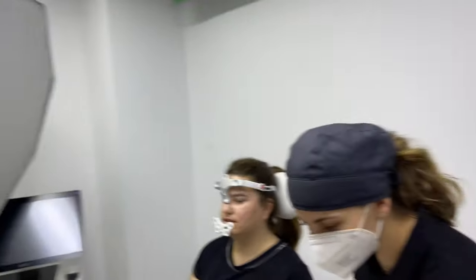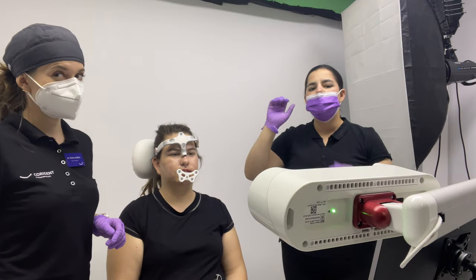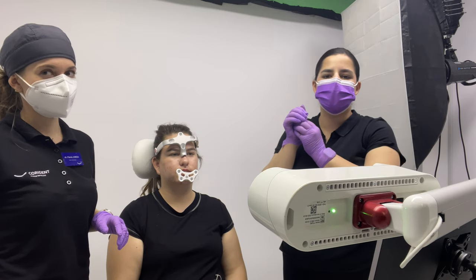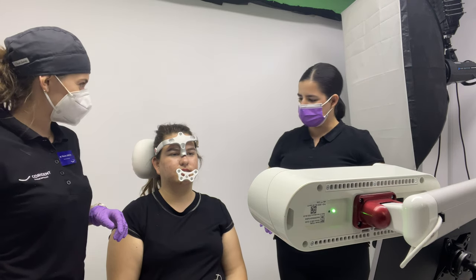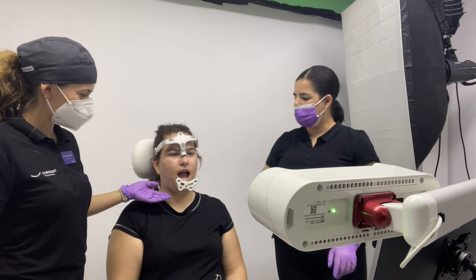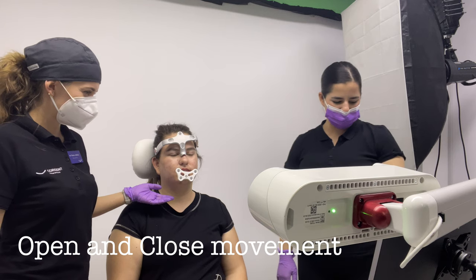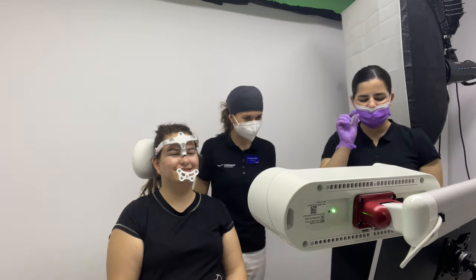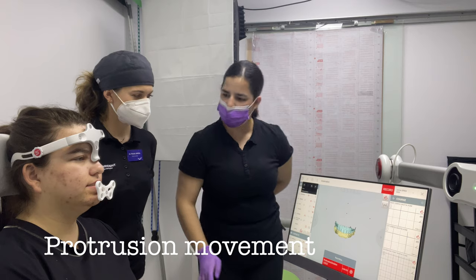And now I will need your help, Bianca. So she needs to bite 3 times quick, so that we know that every time we record a position, she's starting from the same position. So she's going to start now from closing as all the times. So do the tap tap tap. And now we'll hit play. And you can open and close 3 times. Open and close, I hit it. Right, you press stop. She has a slight deviation. And now we hit play. Yes, and do it.